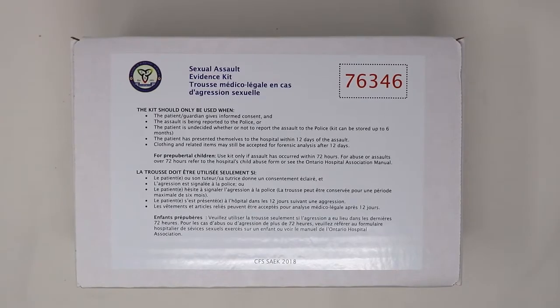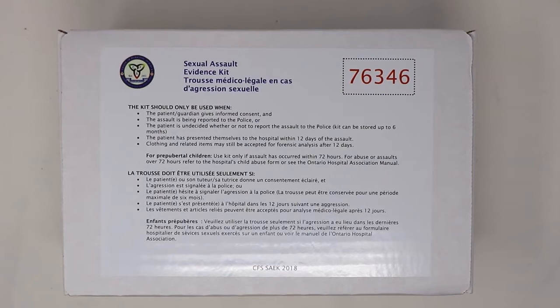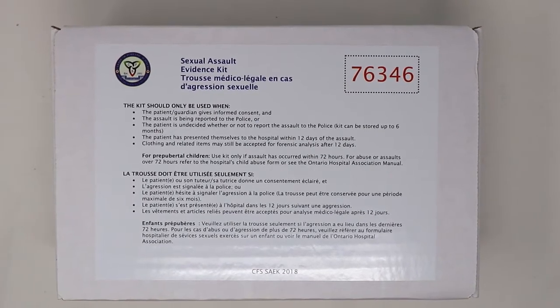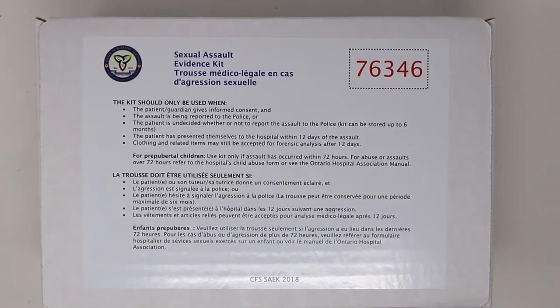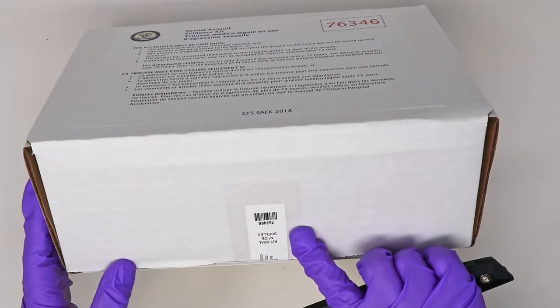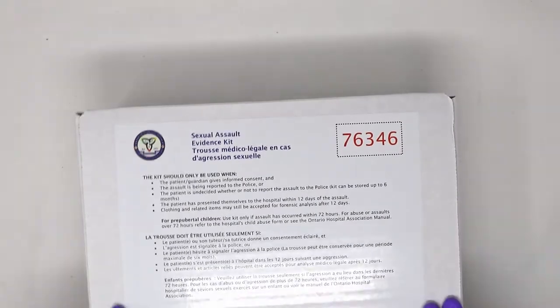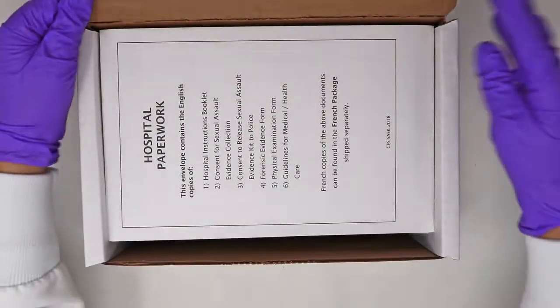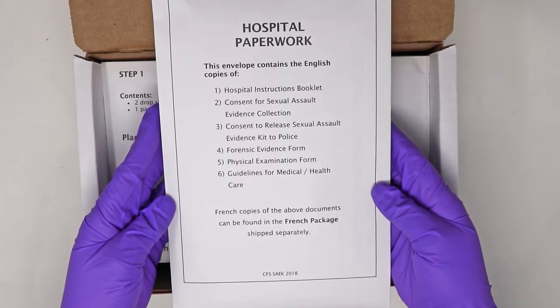The core kit contains all of the paperwork and collection items that are frequently used and is identified by a unique sexual assault evidence kit number in the top right-hand corner. It is used for one patient only. The seal is broken on the core kit at the time that examination is about to commence. The kit should not be left unattended after this point in time to ensure the continuity of all evidence.